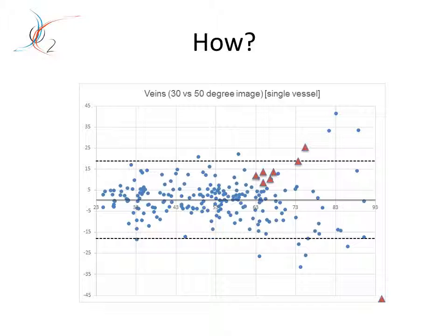Maybe for the first couple of visits they would hover around within the limits, where you could get at least some information, okay in a safe area, whereas maybe with time, if you keep plotting it, you can see how they slowly move outside this zone, and that could represent a measure of progression, but also give us a little bit of a timeline of how things get worse over time or how things improve over time.